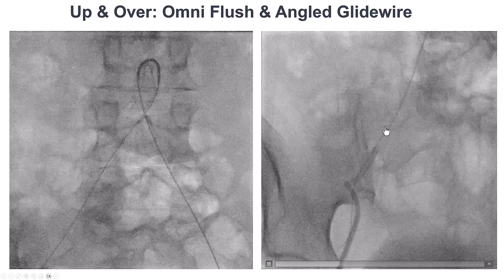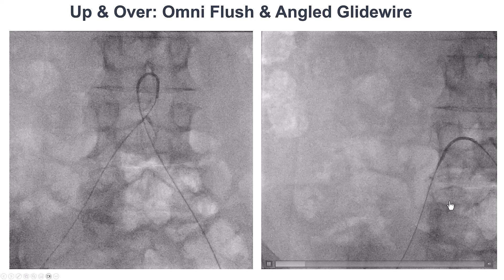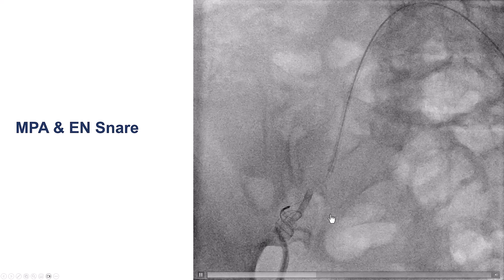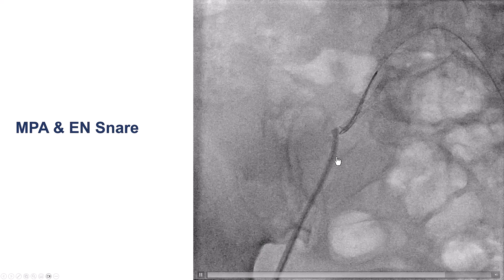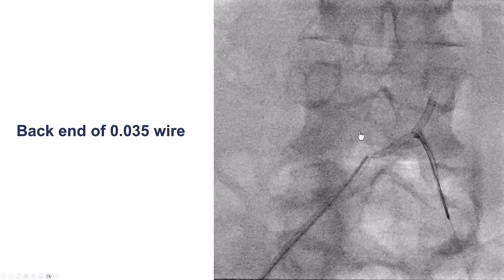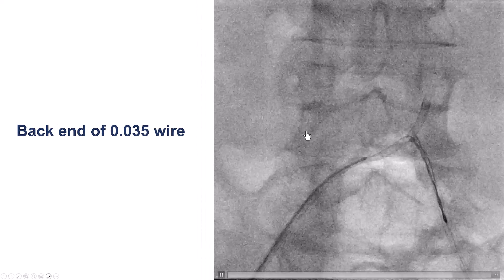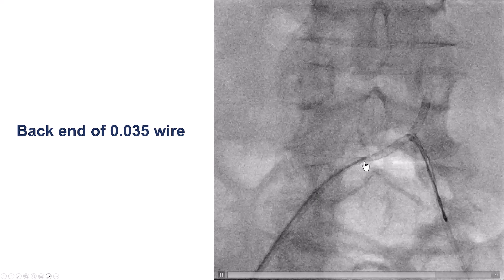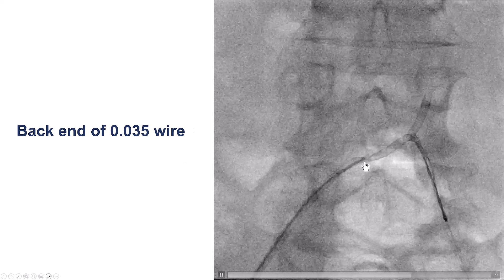In this case, we used the Navicross catheter to go up and over, gaining left femoral access. We were able to deliver an EN Snare into the right iliac artery, capture and snare the kinked guide, and move it further up into the iliac artery. We then tried to untwist it, which was difficult. Despite multiple attempts, we were unable to insert a 0.035 wire from the front or back end through the area of the kink.